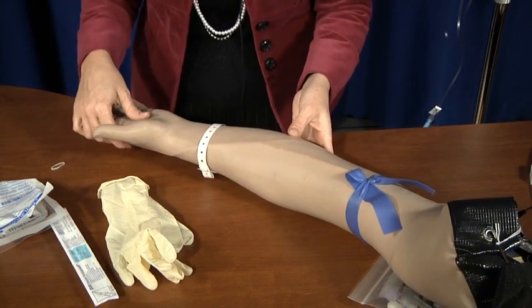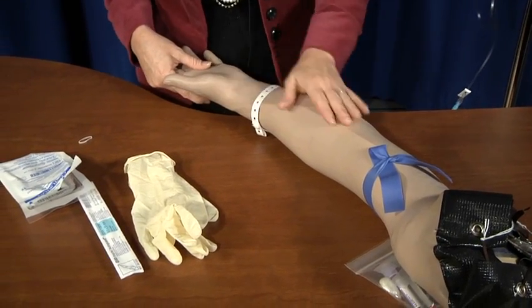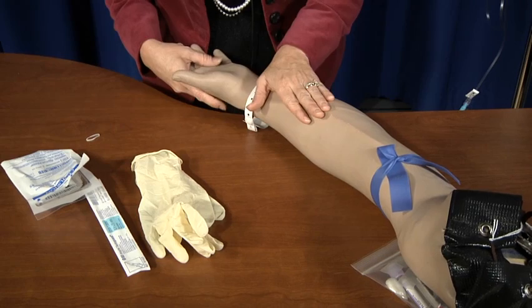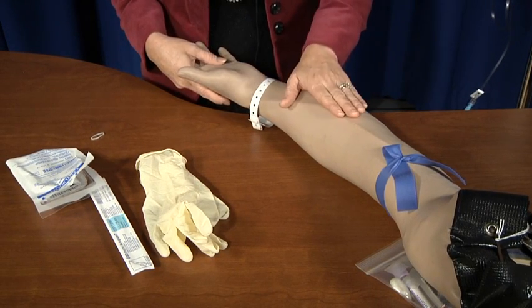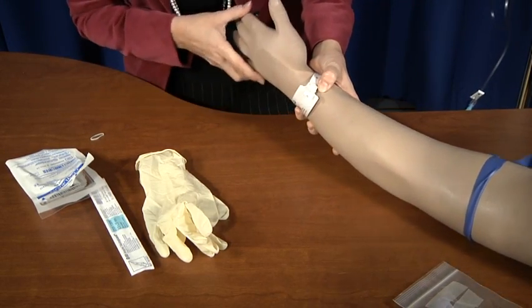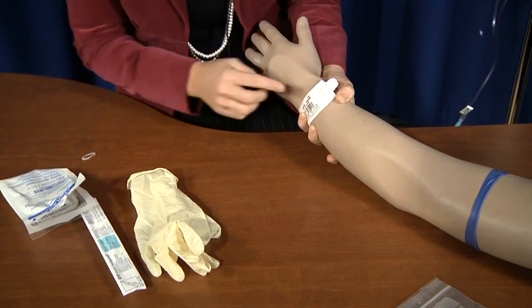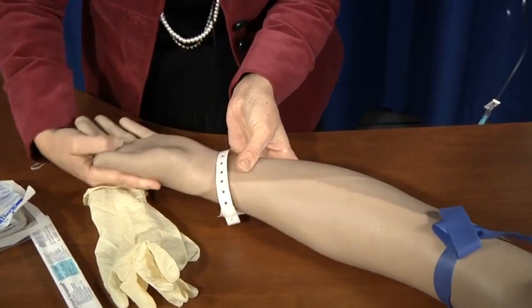The next thing you want to do is put the arm in a dependent position. Let gravity be your friend. If you still don't see something that you like, you can tap a vein gently, or you can put some warm compresses. Now, on this particular gentleman, he's got several long, straight veins.